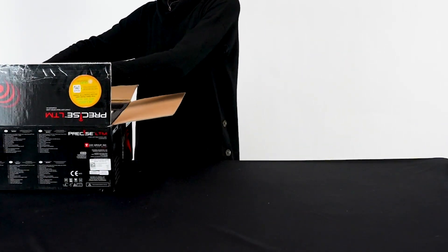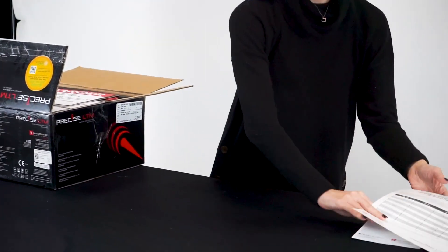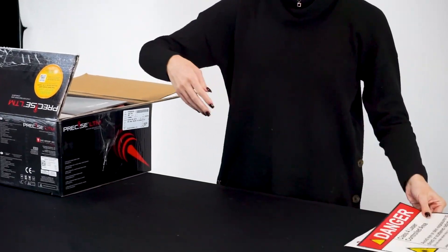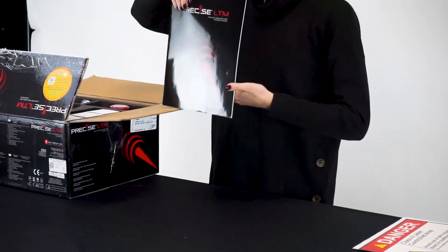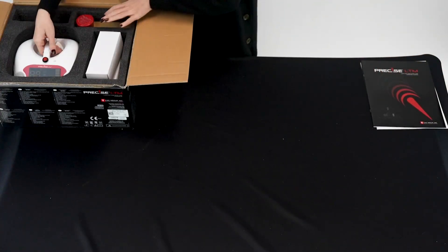Included with your CAO Precise LTM is one quick start guide, one laser safety sign, one owner's manual, and one procedure guide.